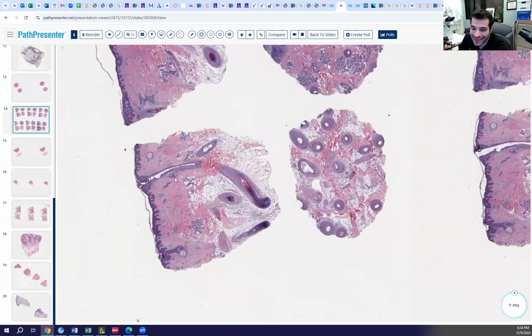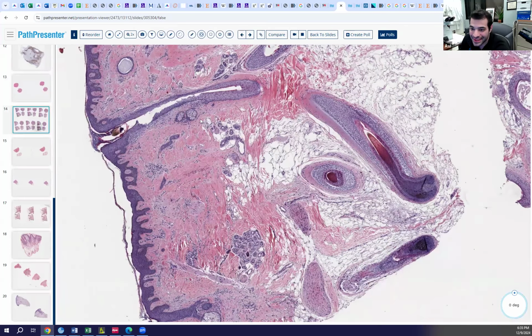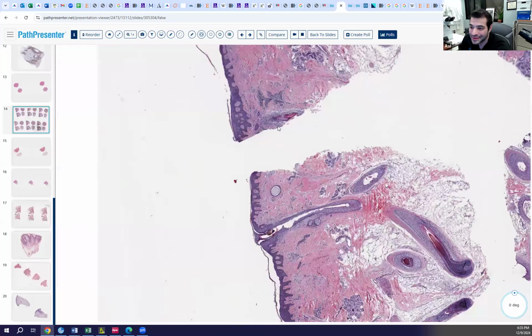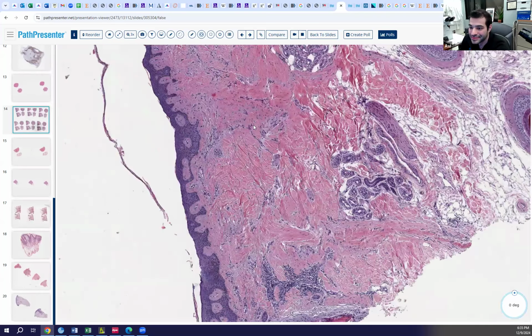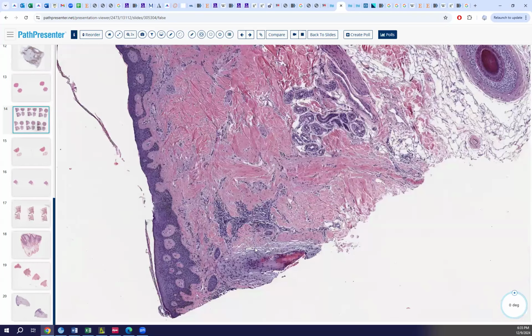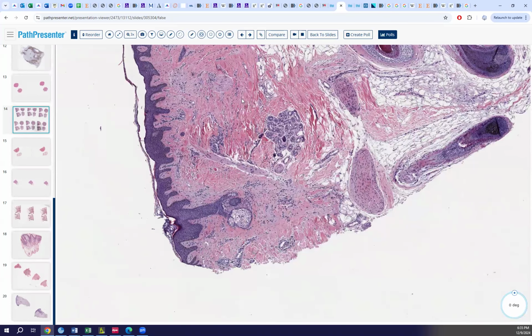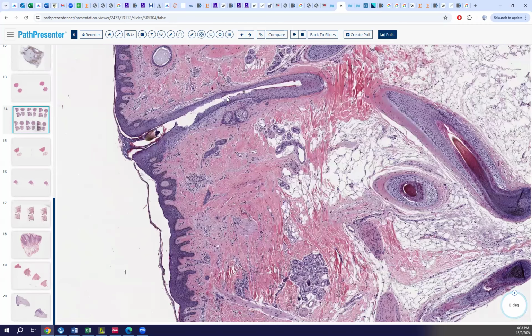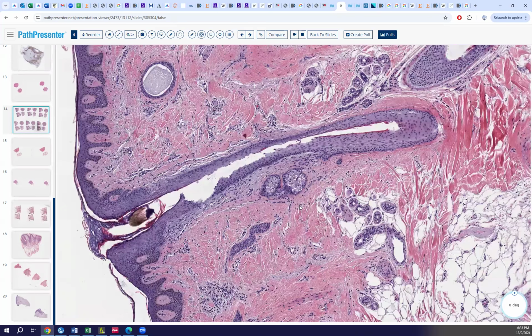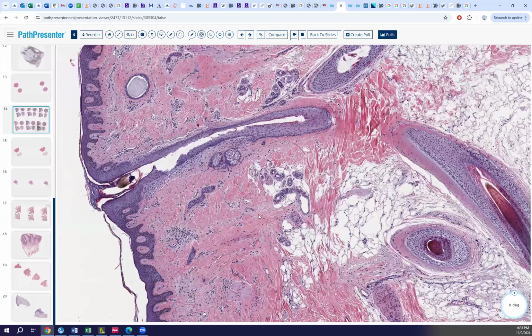And so this just correlates. See, what are these hairs missing? This one still has it, but it's on its way out. So just to clarify, guys, we can't distinguish between LPP and CCCA microscopically. Any of the scarring alopecias, if lymphocyte predominant, we can't do it. Some people use premature desquamation of the inner root sheath, and you'll read about that as something specific for CCCA, but you really need clinical to help you out.